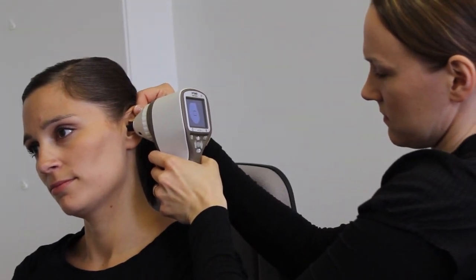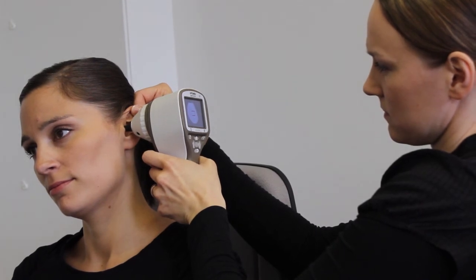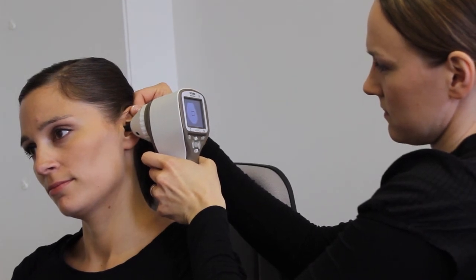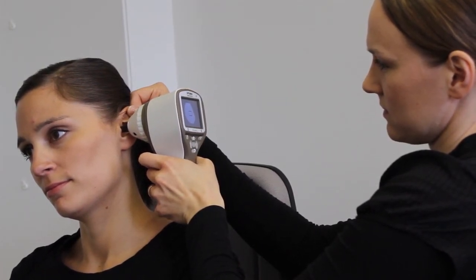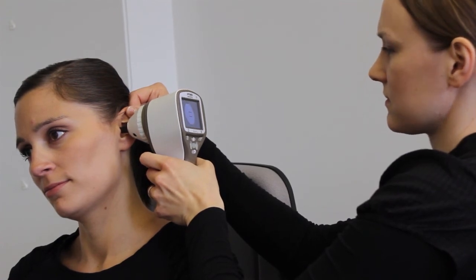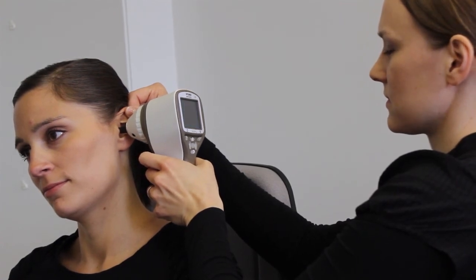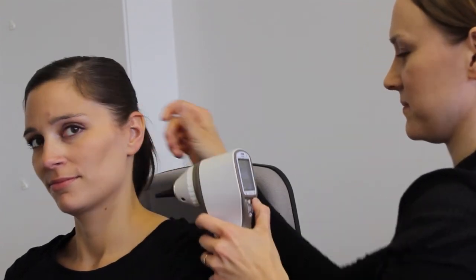If needed, activate the zoom by pressing the right soft key. Use the arrows up and down to adjust the zoom level. Capture the image by pressing the shutter button.